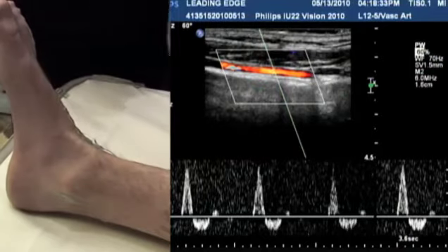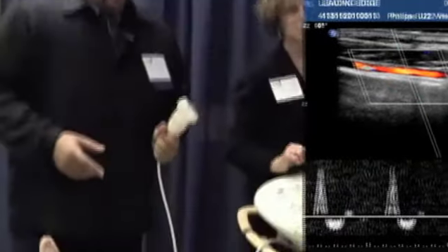in this normal patient. So that's the evaluation of the patient with suspected peripheral arterial occlusive disease. It's essentially a straightforward technique. Of course, it's much more straightforward in this patient who doesn't have any disease at all. It can be quite challenging in patients with multi-level occlusive disease, but if you use the techniques that we described, I think you'll be able to facilitate a complete examination.